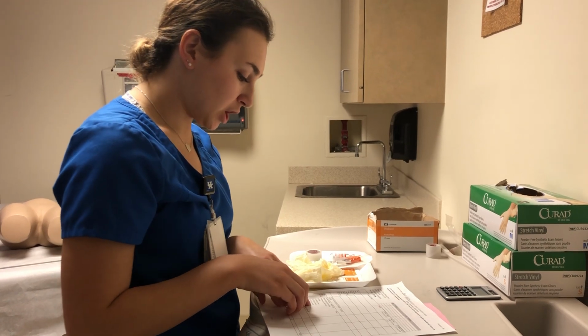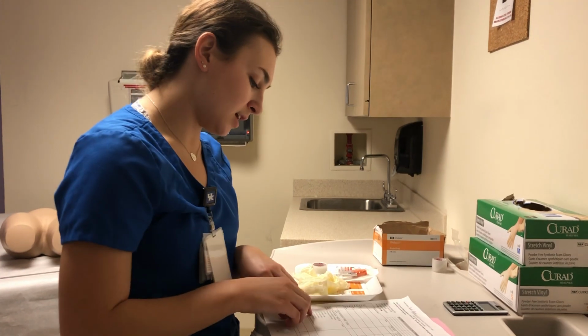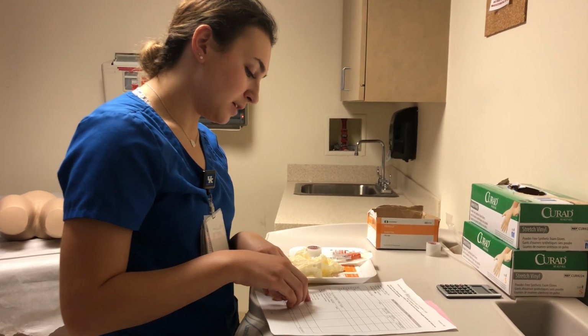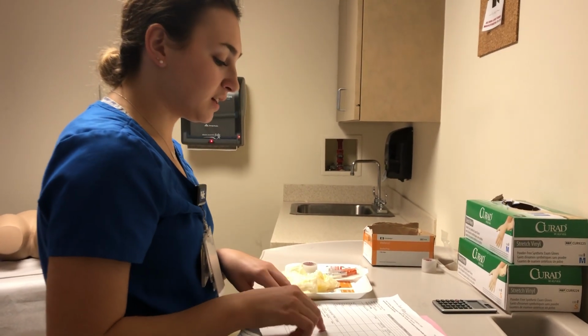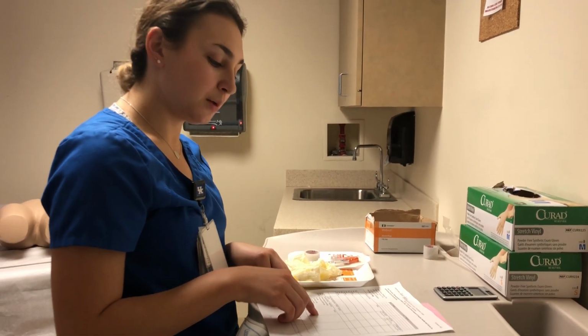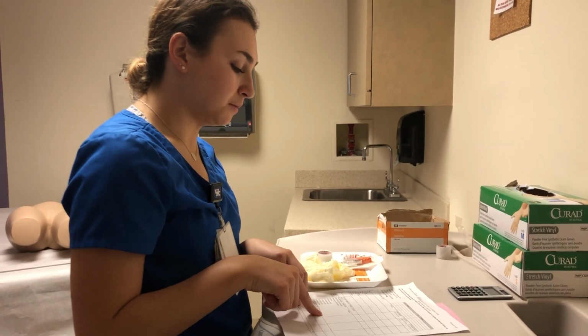I will be administering 6 units because my patient's blood sugar is 258, and from 251 to 300, I am supposed to give 6 units of regular insulin. The time is 11 o'clock in the morning, and my patient has not had any previous injections of insulin, so it is safe to administer.